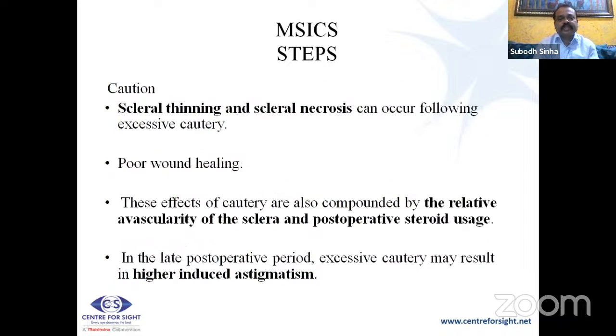The problem with excessive cautery may be scleral thinning, scleral necrosis and poor wound healing. This is further compounded by the fact that the sclera is a relatively avascular tissue, and postoperative steroid use may lead to delayed healing.